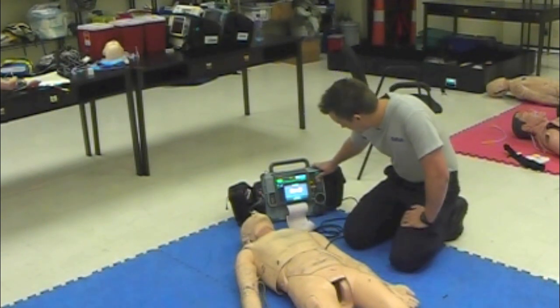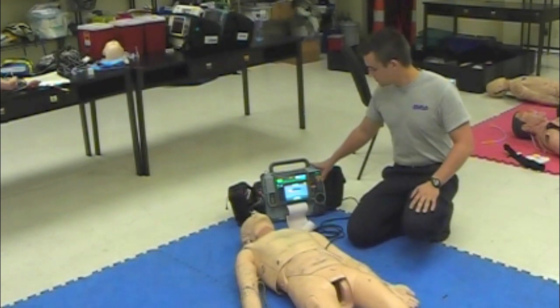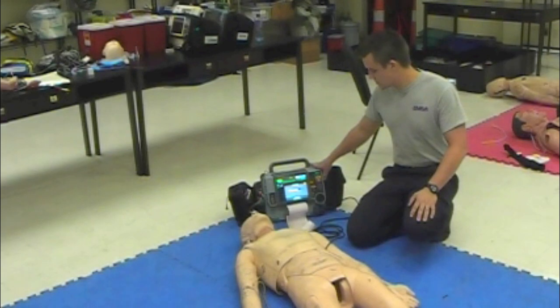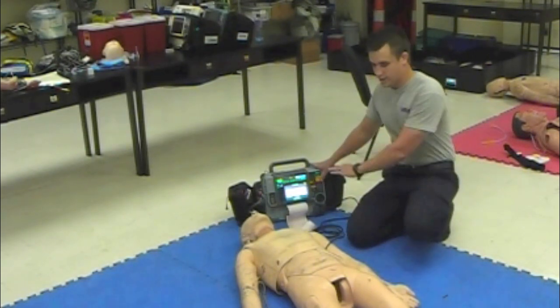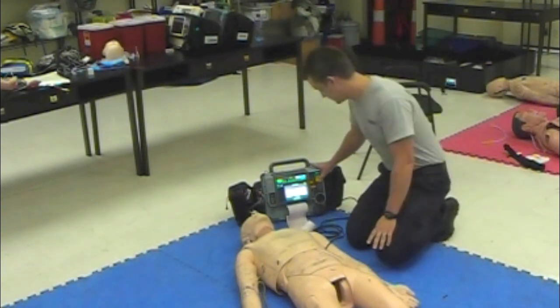Synchronize it, and still giving ventilations as I charge it up. Okay, off ventilations, I'm going to watch my patient, make sure no one's touching it. And we're going to shock on 3. Ready? 1, 2, and 3. Shock delivered.